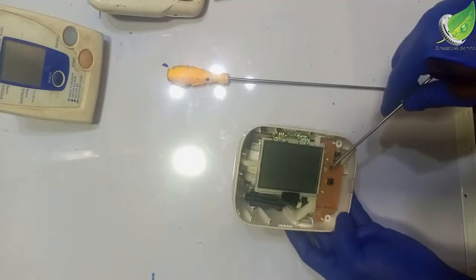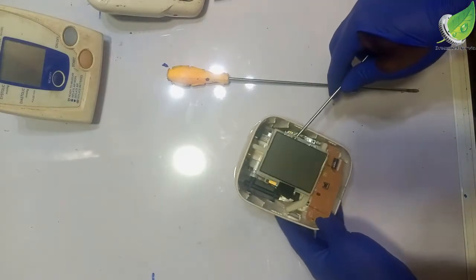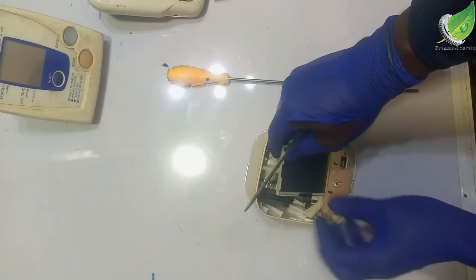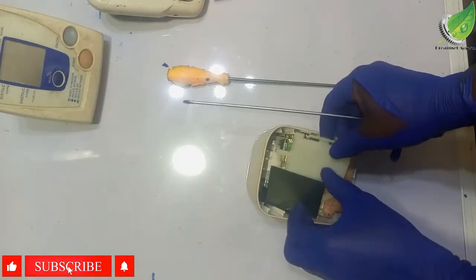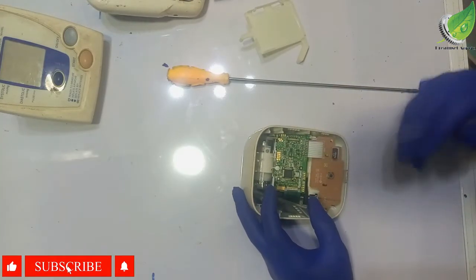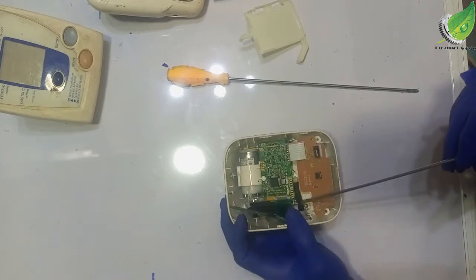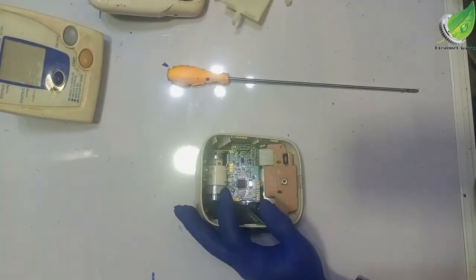So this is the PCB board. We just gently raise it up a bit, and then gently raise this, and then raise it on this side this way. So if you look closely here, you will see what looks like a motor. The main purpose of this motor is to pump air into this valve, and then it comes out through here, while this will take the air into the cuff so that the reading can take place.